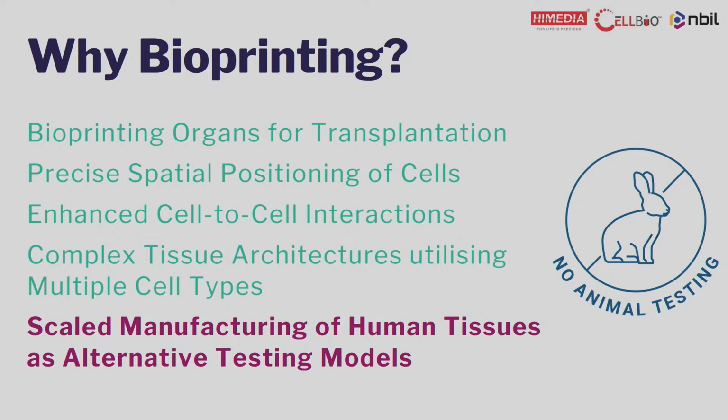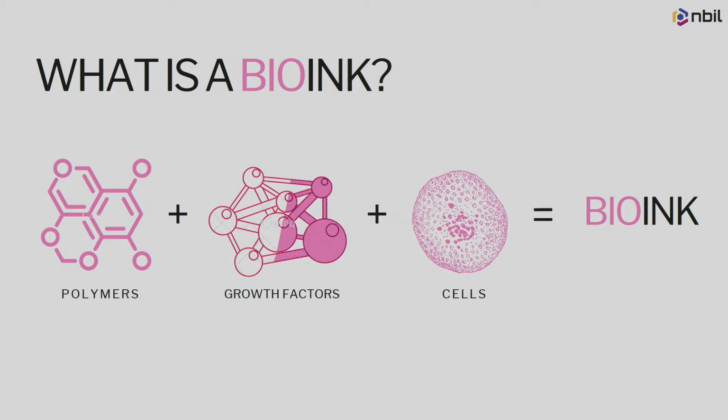Now, what is a bioink? Bioink comprises biomaterials, growth factors, and any kind of cells. Now, cells have to be encapsulated around a proper bioink, biomaterial. Now, these cells have to survive throughout the process of your printing. Now, when you're putting the cells inside the syringe, they have to be extruded from the needle, right? They will go under certain cell stress.